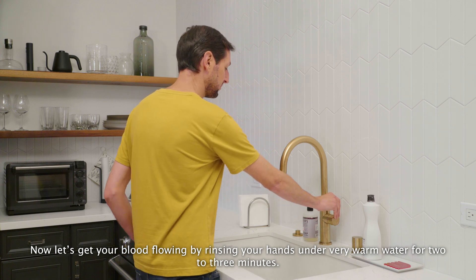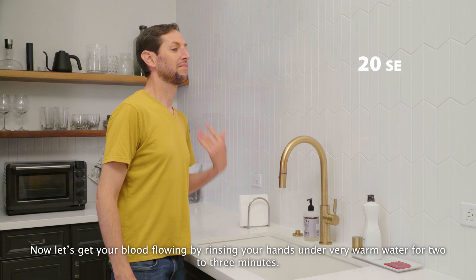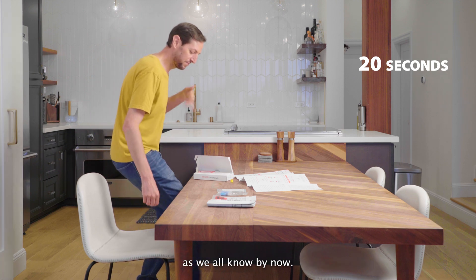Now, let's get your blood flowing by rinsing your hands under very warm water for 2-3 minutes. Shake your hands at your sides for about 20 seconds, which is about twice the length of the Happy Birthday song, as we all know by now.